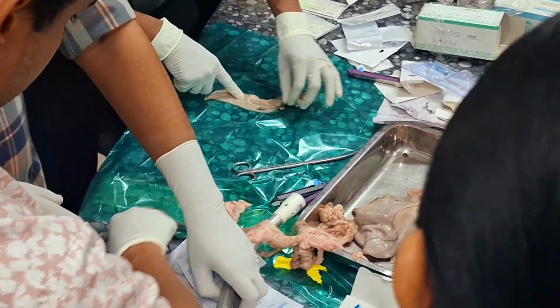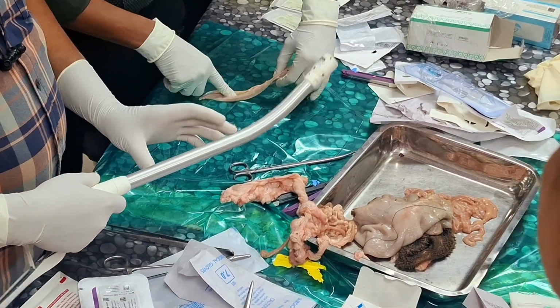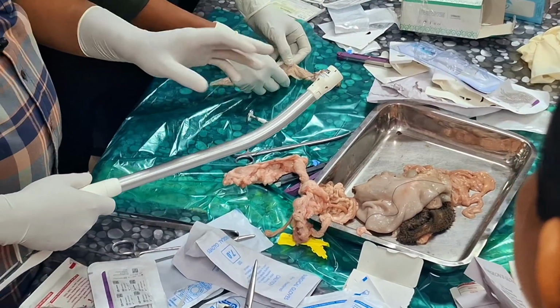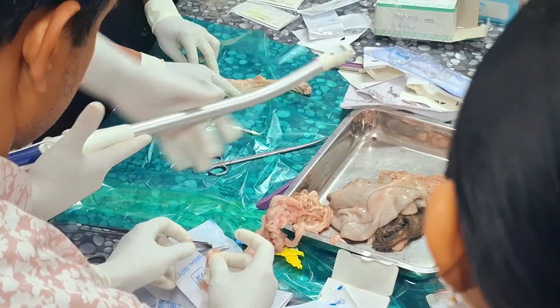This is a curved stapler. This is an end-to-end EEA stapler. That's called end-to-end anastomosis. That is called a GIA stapler. That's a gastrointestinal stapler, which is linear, used side to side. This comes in straight and curved. This is curved. You also have a straight.